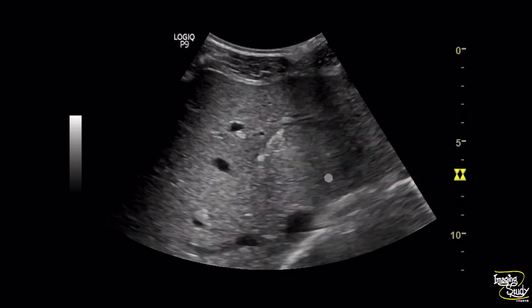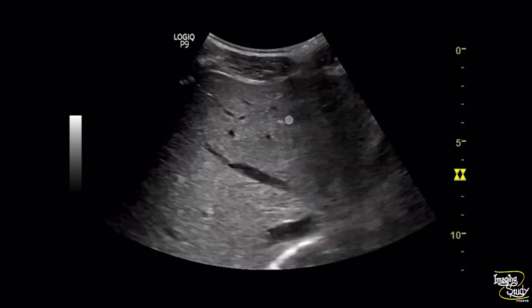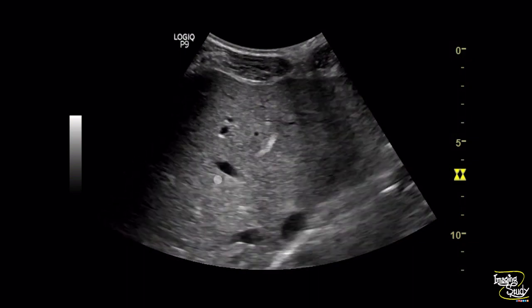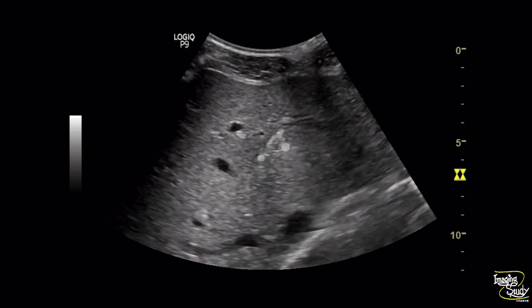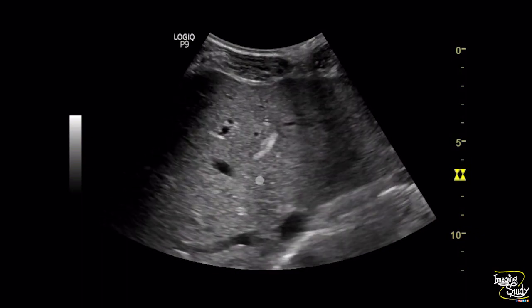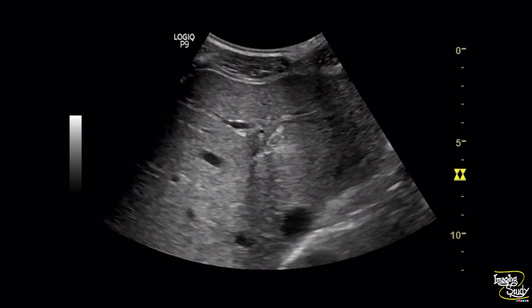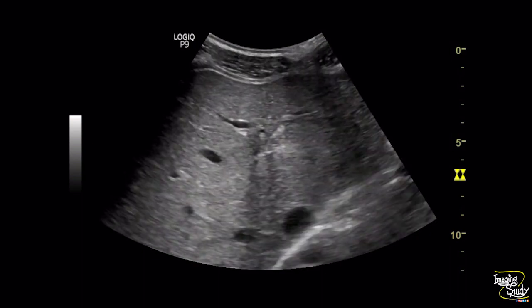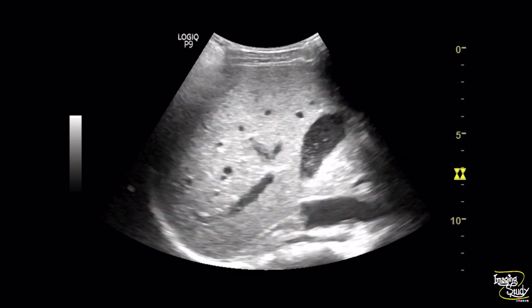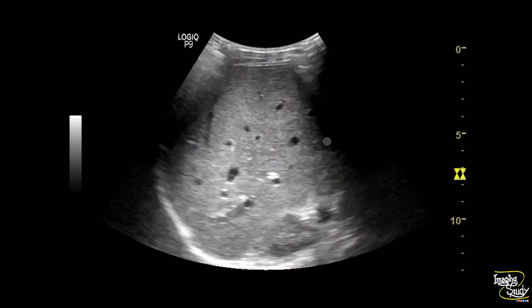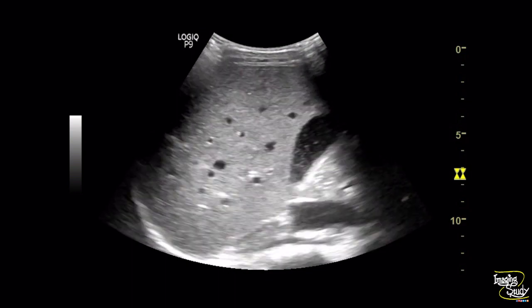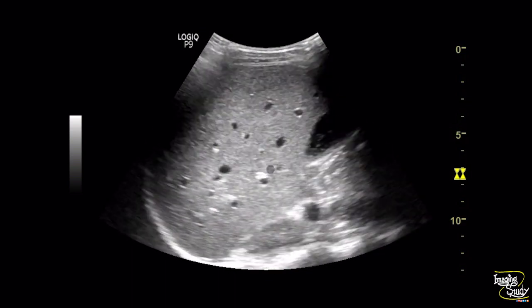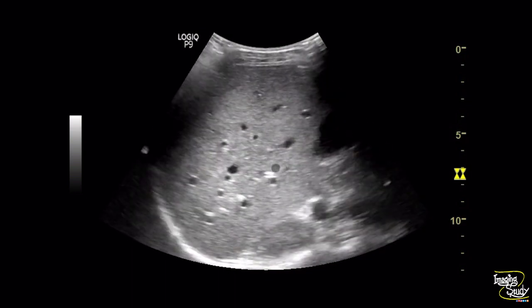Here is another picture and you can see a hyperechoic lesion adjacent to the left portal vein. Another picture shows the gallbladder with luminal sludge, and we can also see a glimpse of the hyperechoic structure adjacent to the gallbladder.